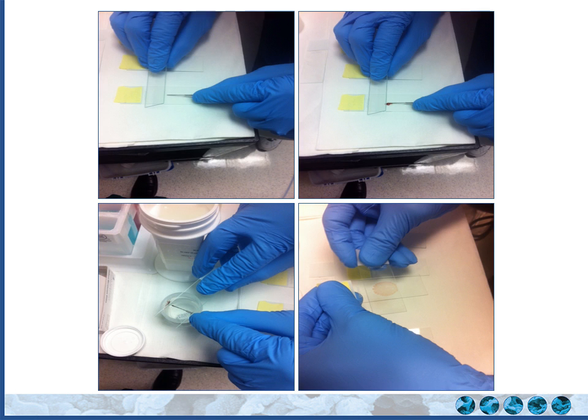So I got my needle, whether you or the assistant. So they're taking the needle. You can see they're putting it on a glass slide there. You express a little, but you don't want to put everything there on the slide. You put a little dot there. The rest is going to go to cell block. And then the technician or your nurse can smear it and make these two smears. And then one is going to go to alcohol. One is going to be dried.